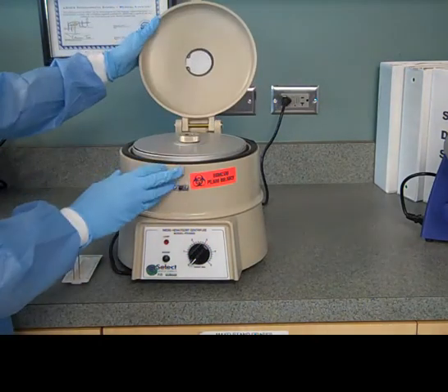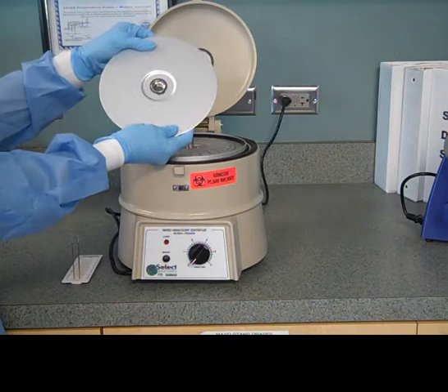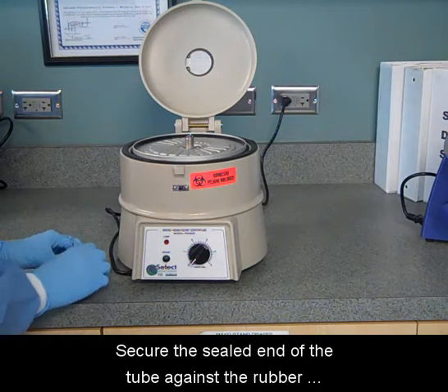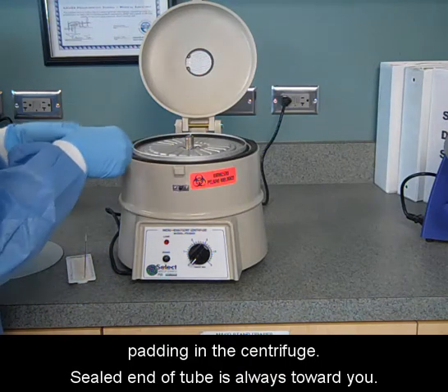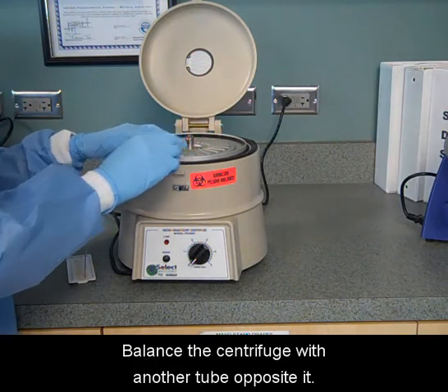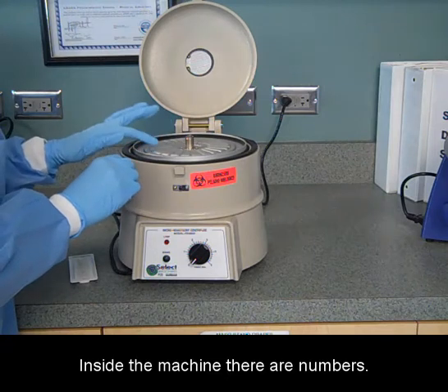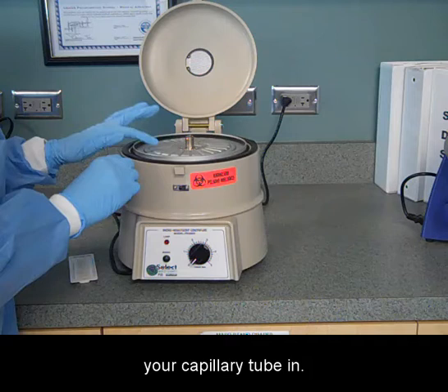Open up the machine. Carefully untwist the top and take it off. Secure the sealed end of the tube against the rubber padding in the centrifuge. The sealed end of the tube is always toward you. Balance the centrifuge with another tube opposite it. Inside the machine there are numbers — make sure that you document what number you place your capillary tube in.